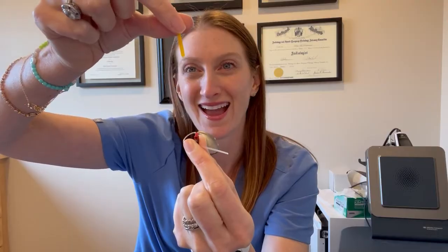And then you're just going to lift it straight out, and it's gone. Okay? Then you're going to flip the stick over to the other side, and you're going to insert it just like that. Again, don't force it, just push it in, but it's okay. And then you're going to lift it straight out. Okay? And now you have a clean white tip. The purpose of these filters is to keep the hearing aids working, and the filter actually catches any wax or debris that could go into the instrument.